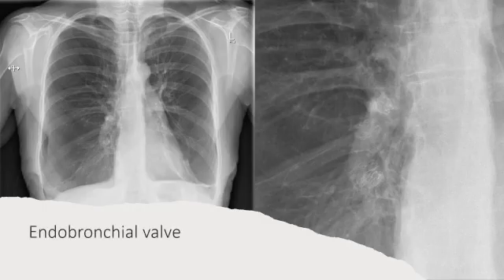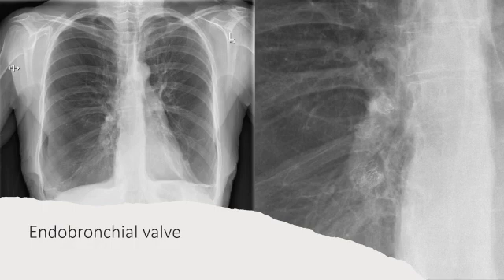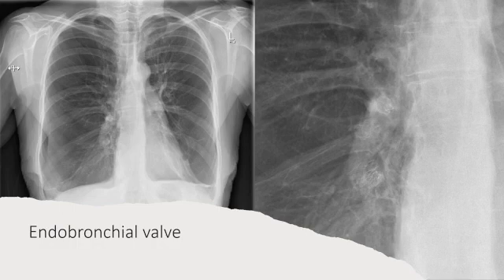Endobronchial valves can be very difficult to pick up on a chest x-ray. Look at the magnified image of the right hilum — these are endobronchial valves which restrict airflow to a particular lung segment. These devices are typically inserted via bronchoscopy and permit drainage of airway secretions outward during expiration, but restrict incoming airflow during inspiration. They were originally designed as an alternative to surgery for lung volume reduction in severe emphysema, and have also been used to treat bronchopleural and bronchoalveolar fistulas with persistent air leaks.